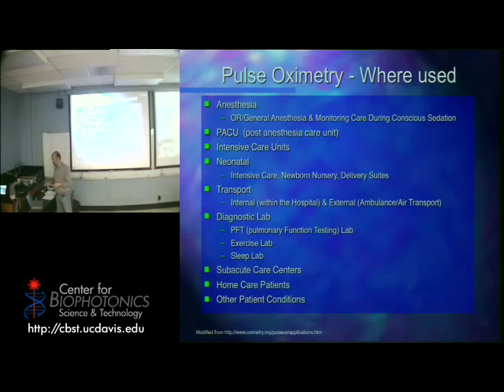Yeah, there's no fiber in there. They don't even use a fiber. They don't need to because the detector is on the finger. Everything's on the finger. All they have to do is send electrical signals. That's all they have to do. It makes it even more reliable. They don't have to worry about kinks or any of that stuff. So literally they have the light on one side that they control electronically, and they have the readout on the other side. I mean the pickup.